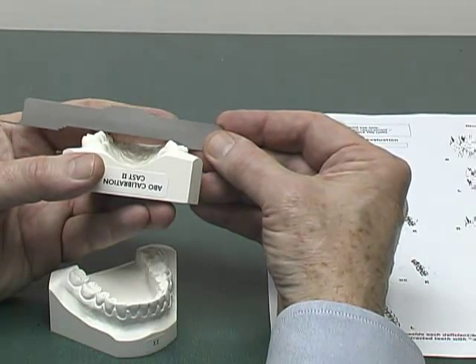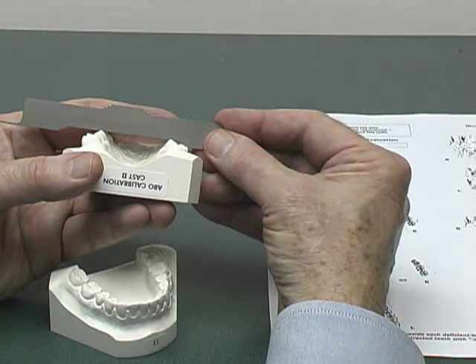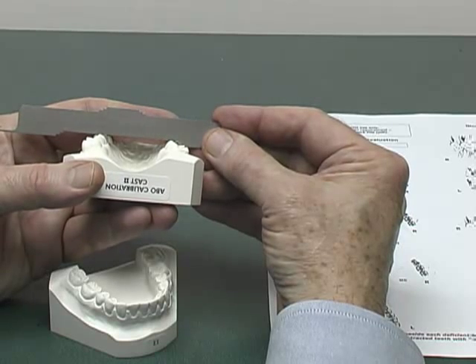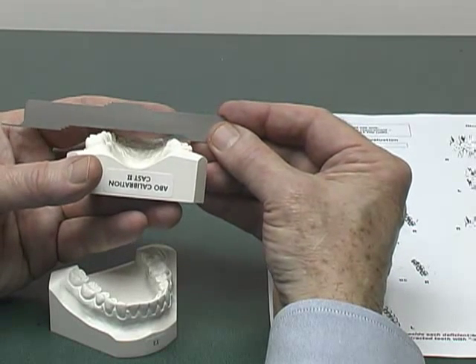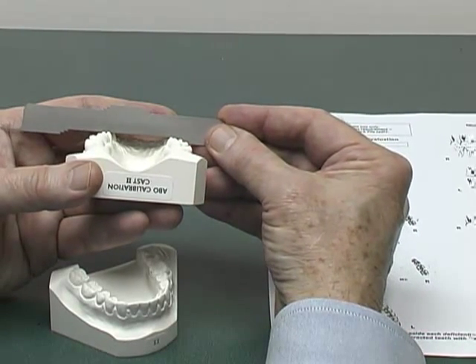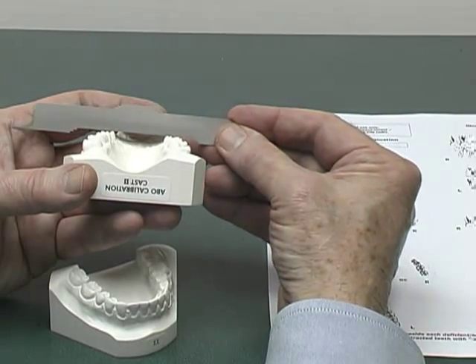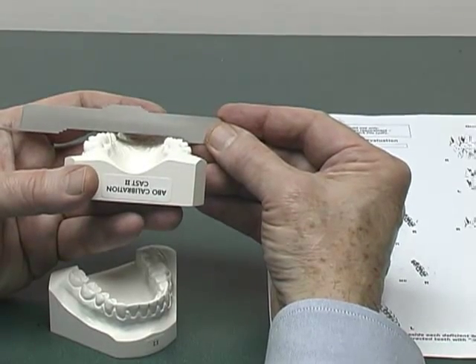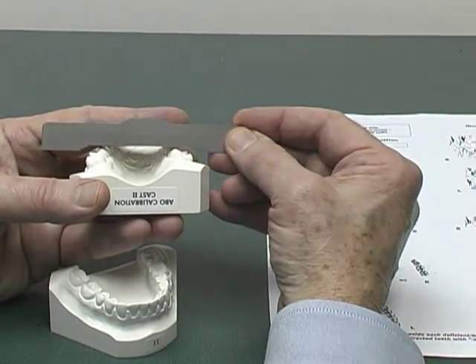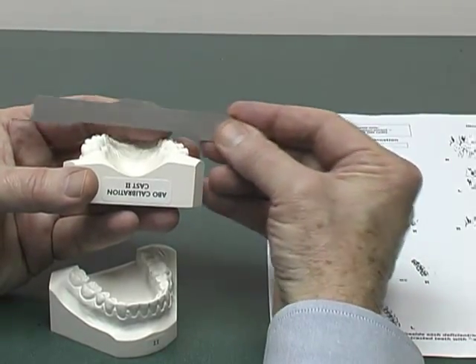Go to the left side, and we see it's between 1 and 2, so that left first molar will be scored 1. Now move to the premolars. The second premolars, as I move back and forth, are all less than 1 millimeter. Let's go to the first ones, and that likewise. I hope you notice that I continue to move forward using my index finger to help support the gauge as you move it back and forth.